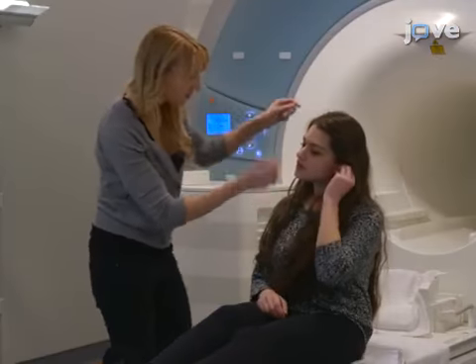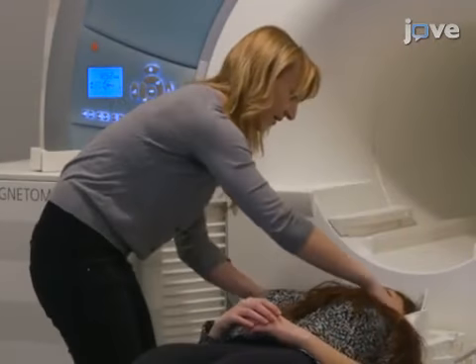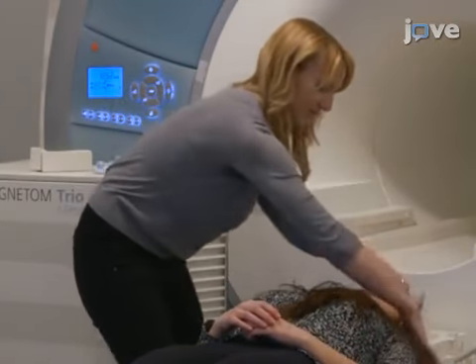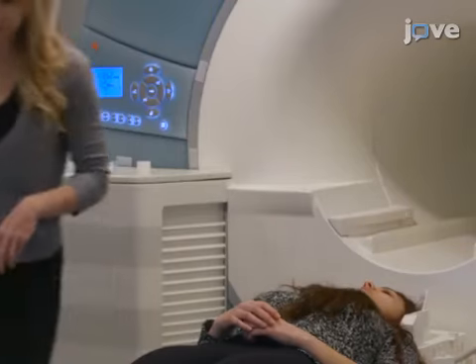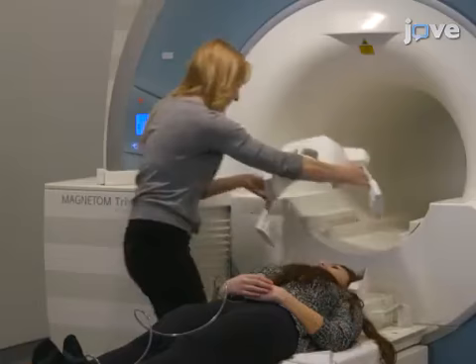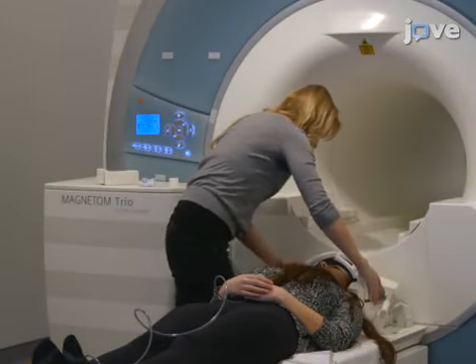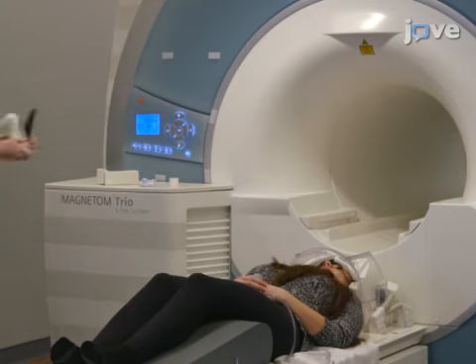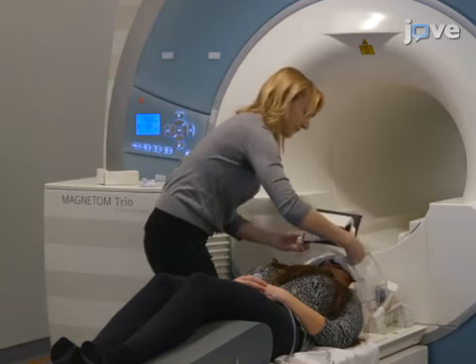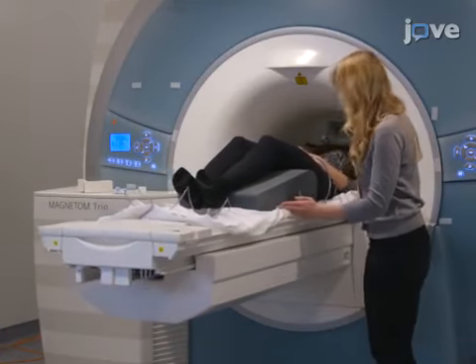Provide the subjects with earplugs for hearing protection before positioning them supine and head first on the scanner table. Provide an alert squeeze bulb. Then place cushions to reduce head motion. Landmark above the eyes at eyebrow level before sending the subject into the scanner.